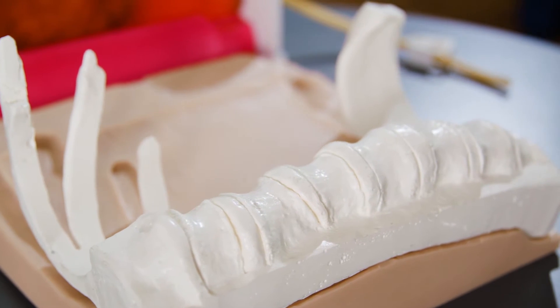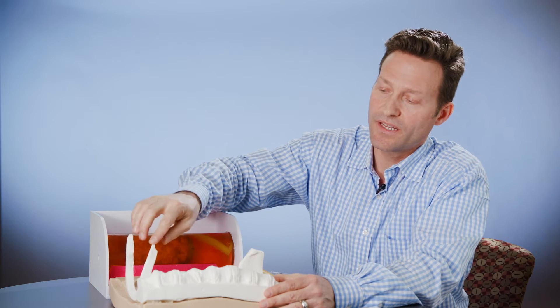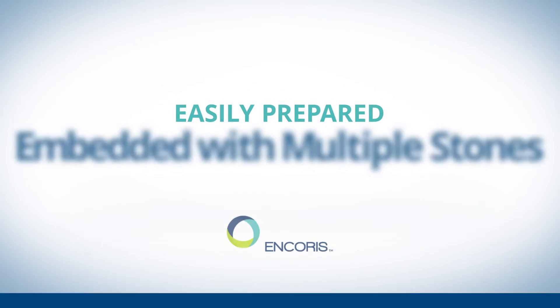On the outside you have the soft tissue flank with an embedded radiopaque bone that offers the key landmarks — these rib structures that are highly radiopaque and provide a very anatomical approach to the kidney itself.